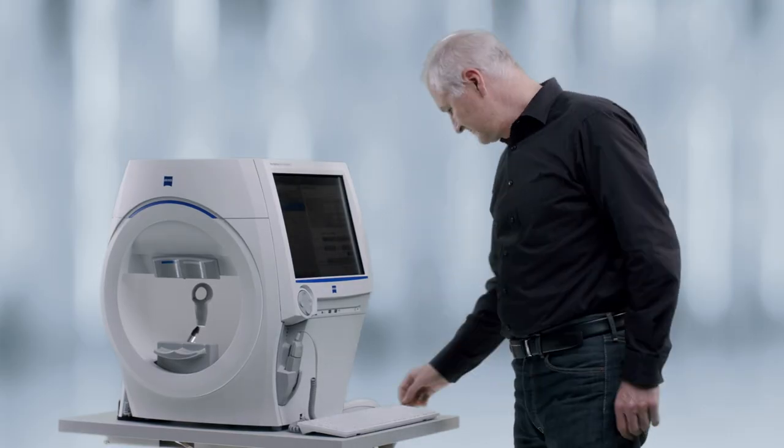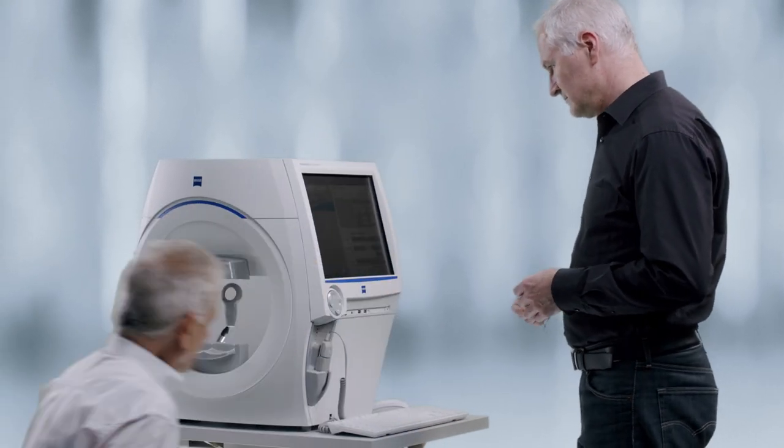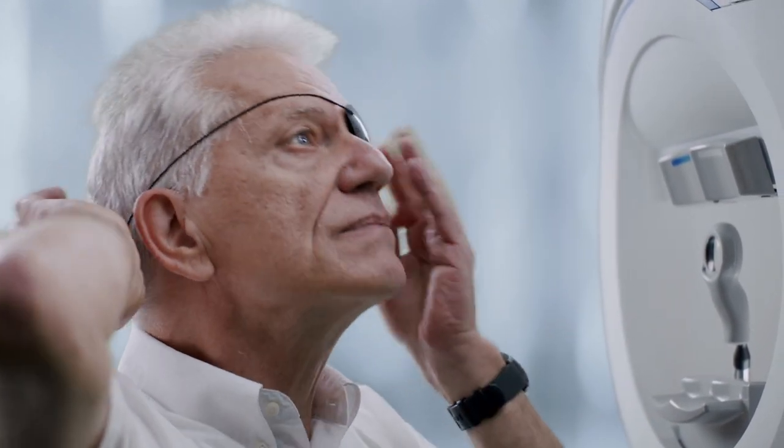When you are ready to test the patient, comfortably seat them in the chair you use with the HFA-3. Apply the eye patch to the non-tested eye. Usually the right eye is tested first, so we'll patch the left eye.